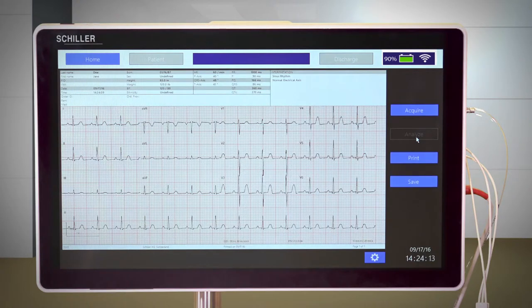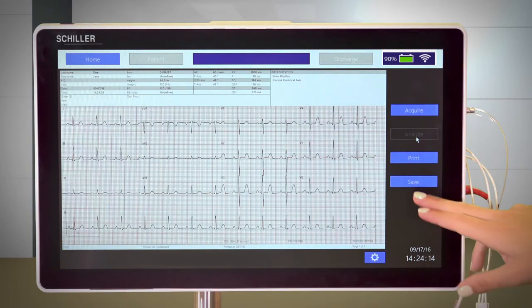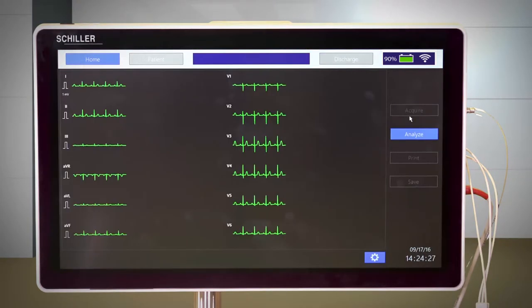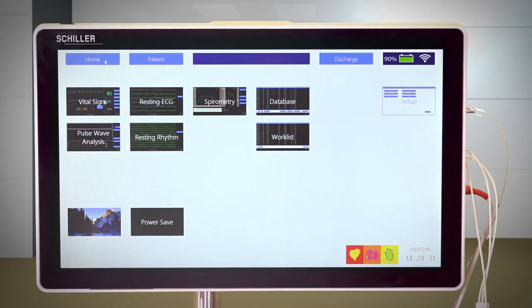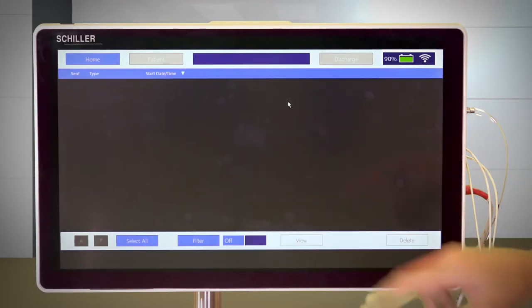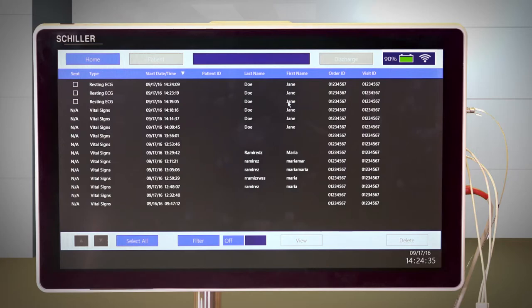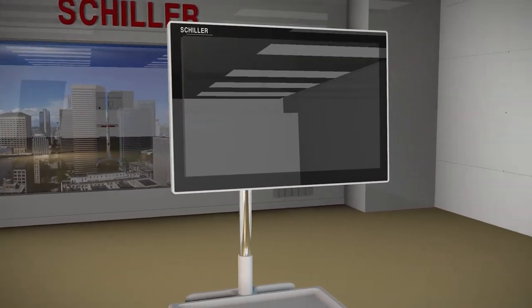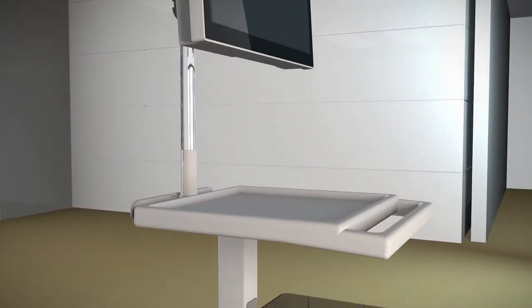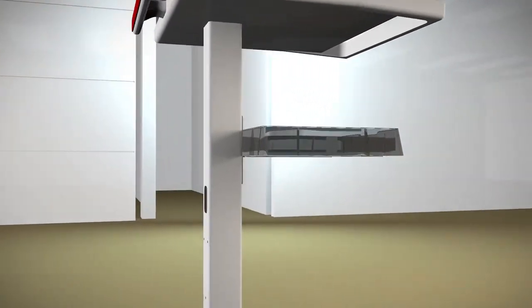we can obtain a report with the patient information and interpretation. The Save button will save a record to the local database and can be sent automatically to the central server. The database will provide storage for the recordings to be viewed later on.